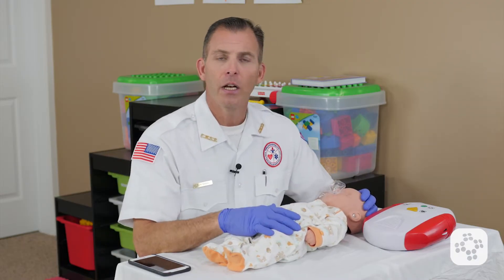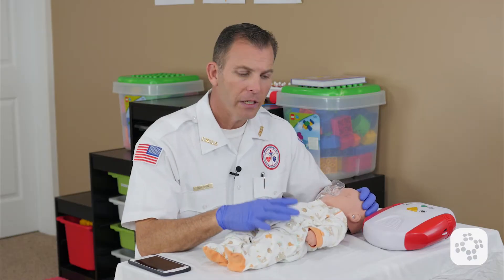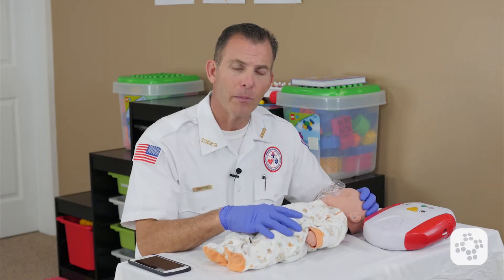While we're talking about wetness and dampness, there's been some questions about a wet diaper and using an AED. A wet diaper is no problem. We're concerned about a puddle or a pool of water that the baby is laying in, not just damp clothing or dampness around the baby.